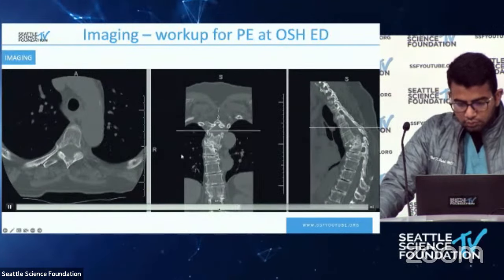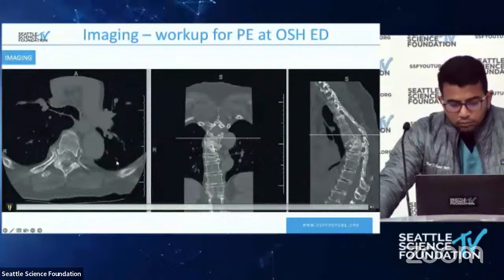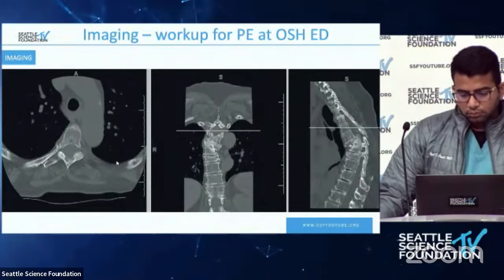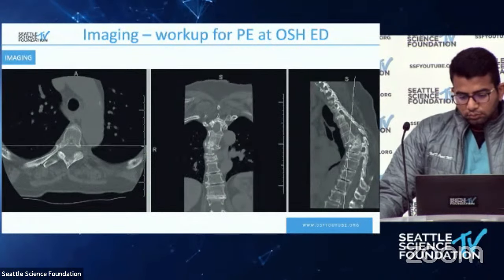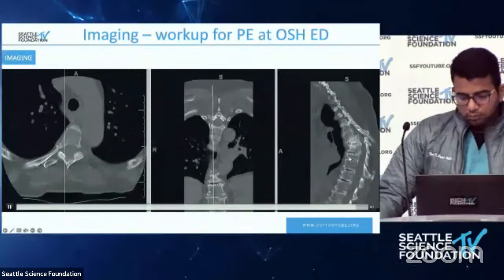So, significant biplanar deformity. Right. Vertebra slipped out of place. I mean, for me, this is Dr. O's patient. This is pretty shocking to see. Also, I was stumbling like you were about what's going on there. But for pure osteoporosis, it's almost a little bit uncommon to have this dislocation.